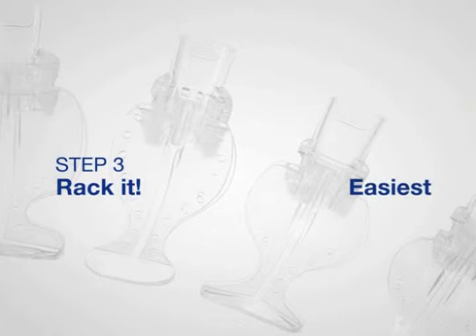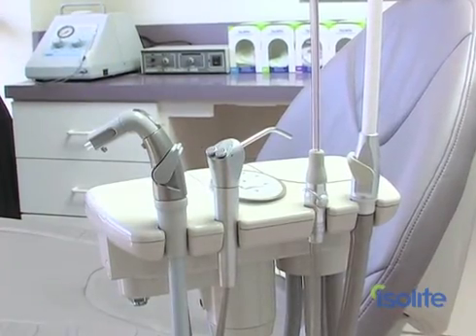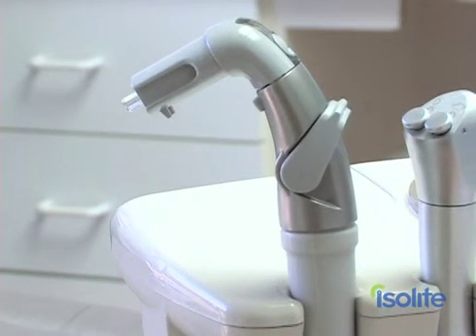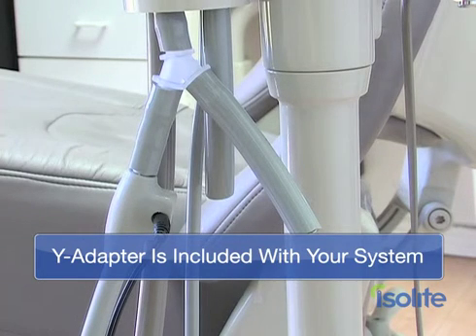The last step for your new Isolite or Isodry? Rack it — the easiest. Racking your Isolite or Isodry is the easiest step of all. You'll want to position your new system within easy reach on the assistance toolbar. Isolite will fit into most high or low volume slots. That's it — you did it. Now, 95% of the time, your installation is going to go just like the method Denise just showed you. But not all vacuum canisters are created equal. Every now and then you'll get in a unique situation where you have to use a Y adapter — but this is just not a problem. Give our customer service reps a call and they'll walk you right through it so you can get up and running in no time at all.